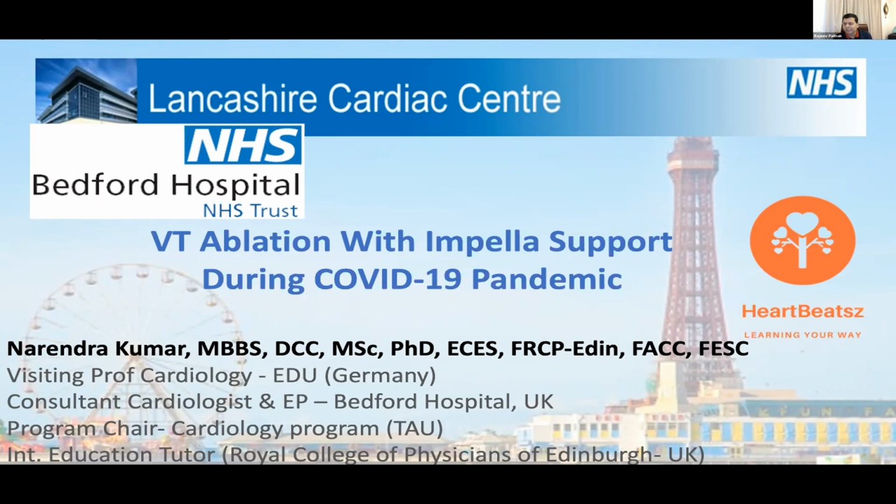Number one, and the most important, which everyone can do, is catheter contact using a force sensing, direction sensing catheter. A good force, longer lesion in a safe area is okay to do. Number two, simultaneous unipolar ablation, when you have two catheters in two different locations, strategically selected so that you can give a lesion in the intramural region. You will need two sets of ablation generators and two people to come on at the same time.